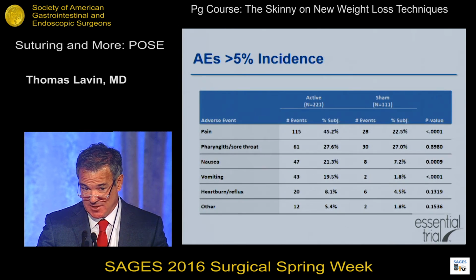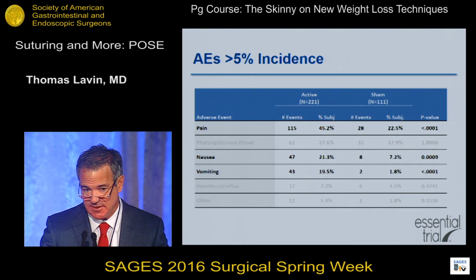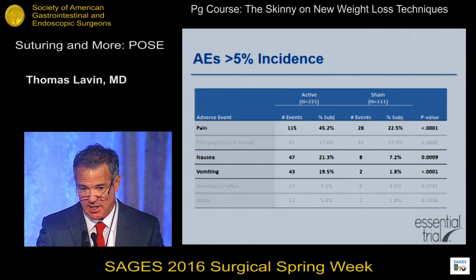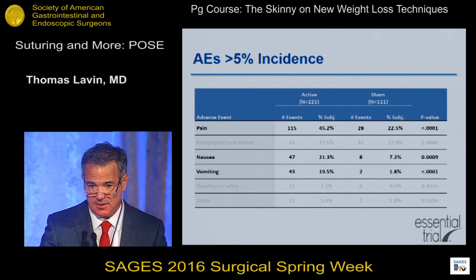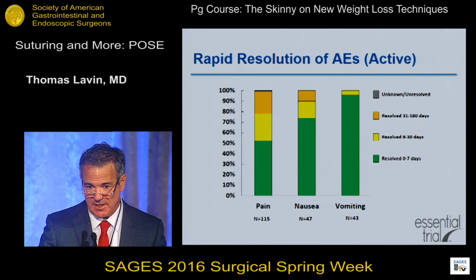So as far as the AEs, there were six that had greater than 5% incidence, and there were only three that had statistical significance between the active and the sham arm, and those were pain, nausea, and vomiting, as you would expect. But they had quick resolution. Basically, you can see with the vomiting, very, very quick resolution within 7 days, as well as nausea and pain.